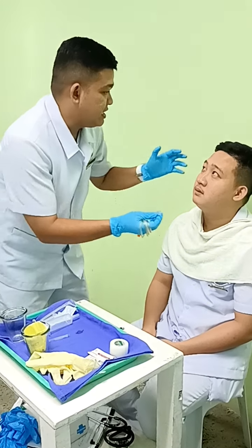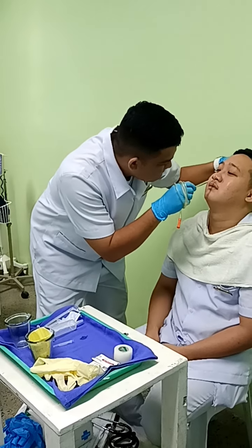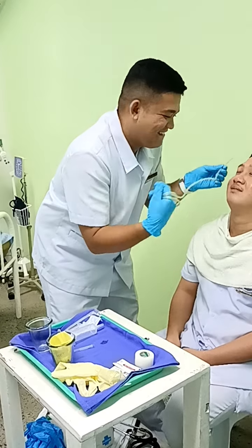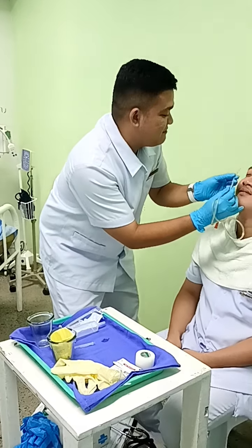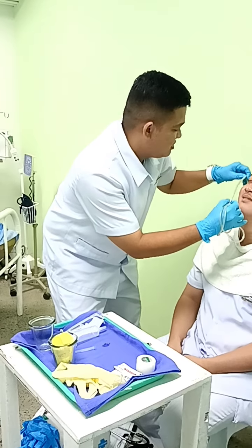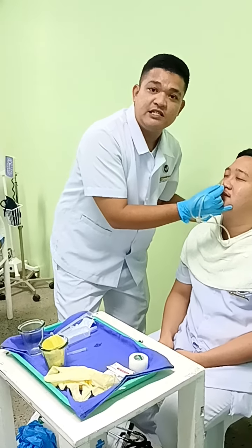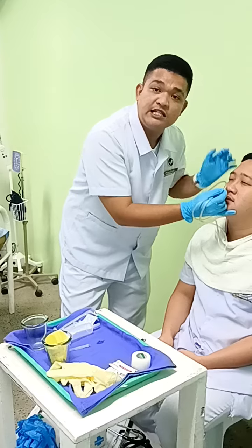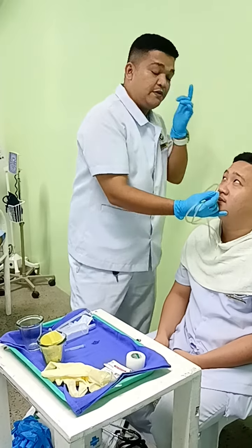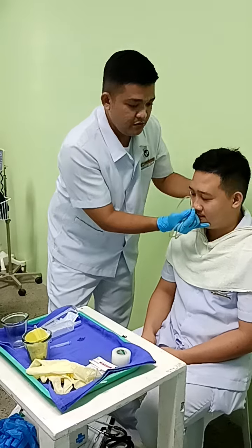Sir, can you please flex your head upward? Okay. Sir, just tell me if you will be having discomfort. Once you reach the nasopharynx, you will instruct the patient again to flex his head forward.